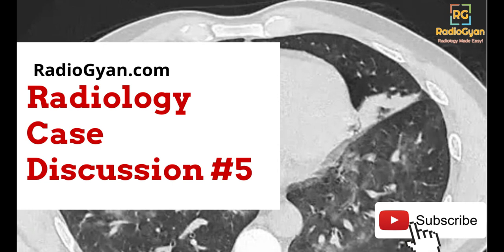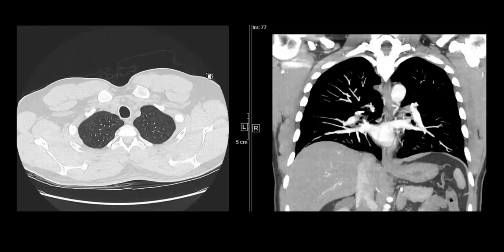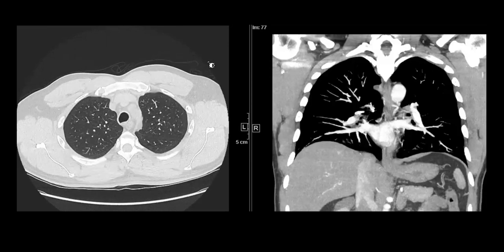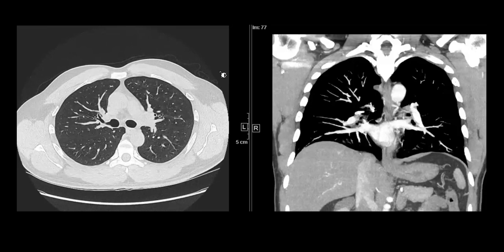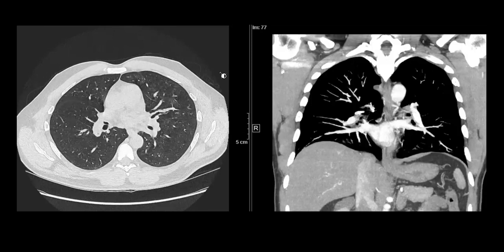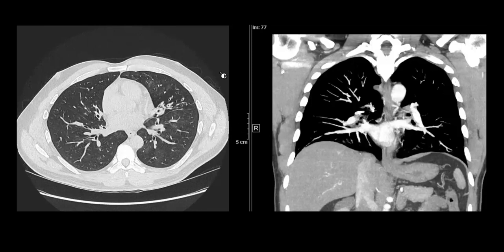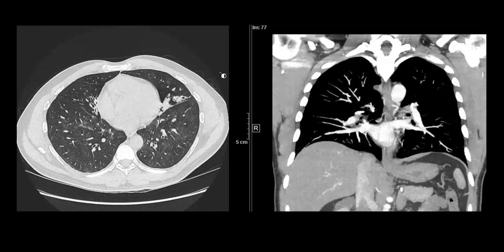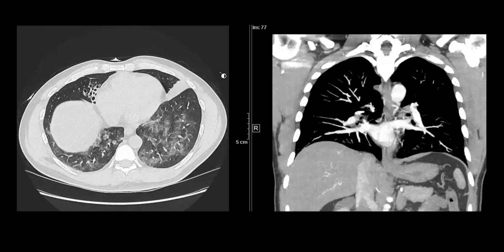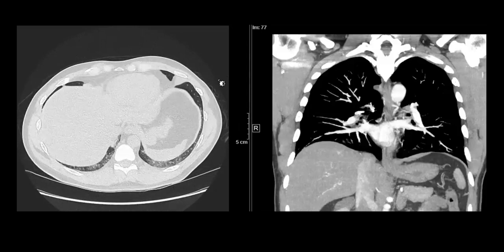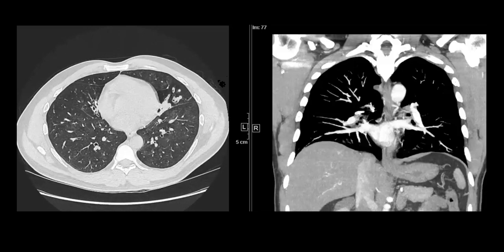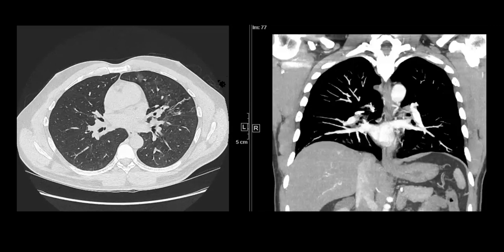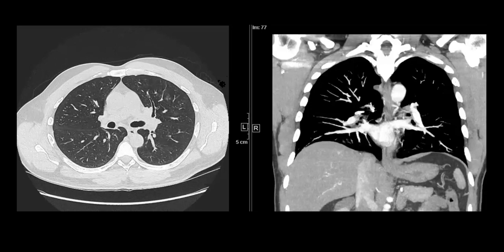We have a patient who presented with massive hemoptysis and we did a chest CT with contrast for him. I'll go through the images and then you can chat in your answers or I will talk about them. We'll give some time for everyone to have a look at the images. As I scroll through the images, you guys can type in your answers in the YouTube comments section and then later check whether you are right or wrong.